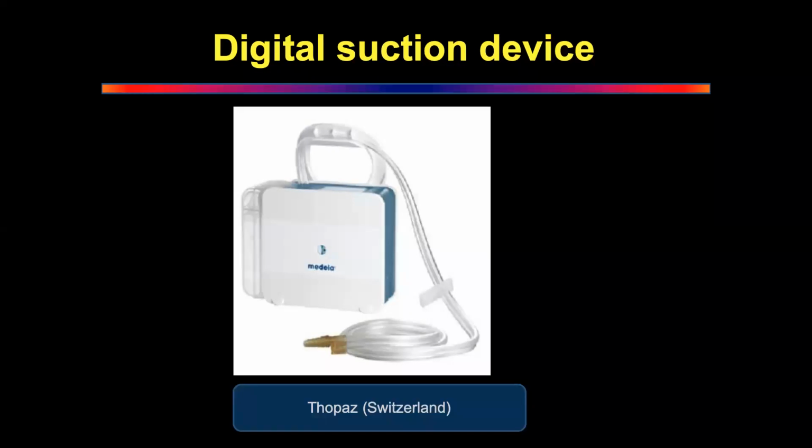There is an anti-frothing agent inside the canister, and there is a non-return mechanism to prevent flow back to the chest.